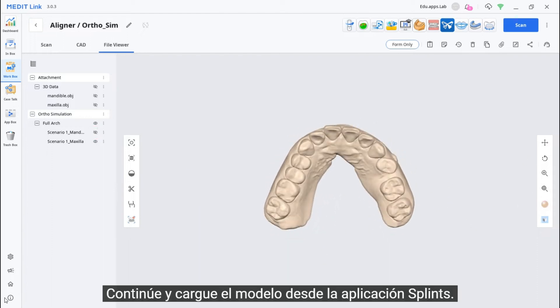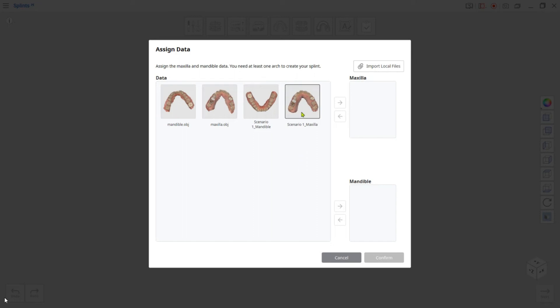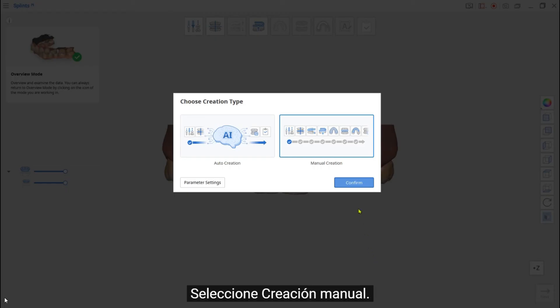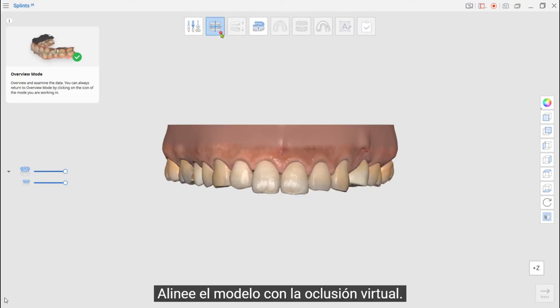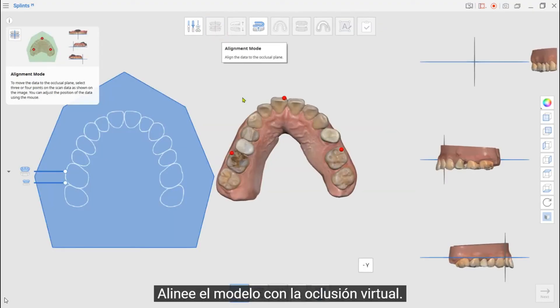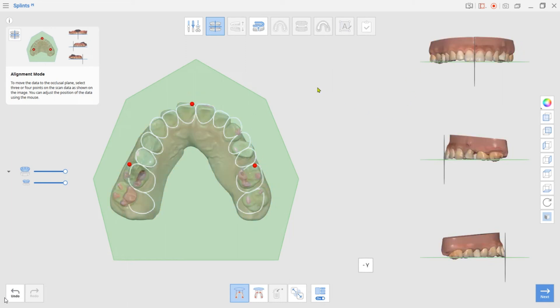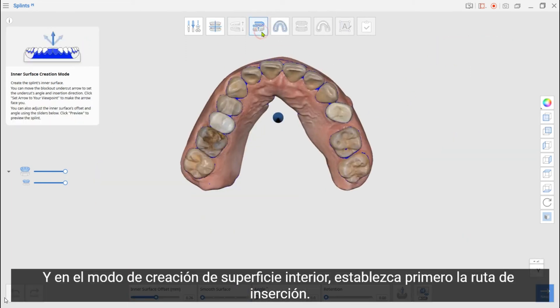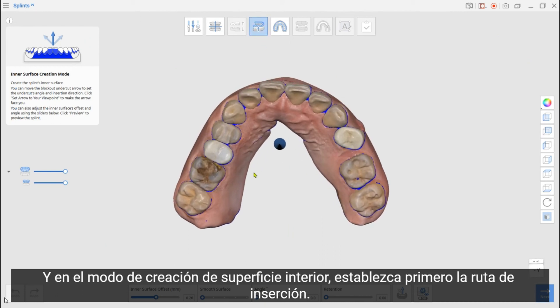Go ahead and load the model from the Splints app. Select Manual Creation and align the model to the Virtual Occlusion. At the Inner Surface Creation mode, set the Insertion Path first.